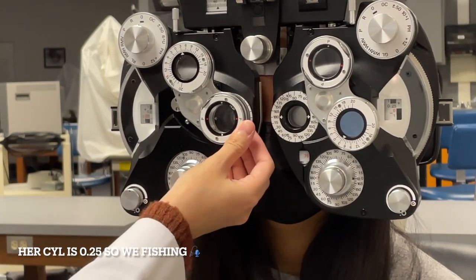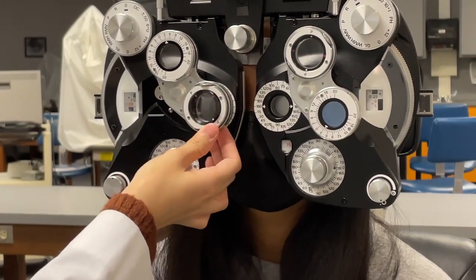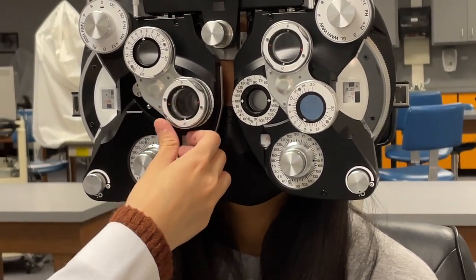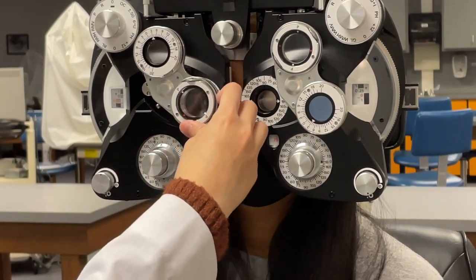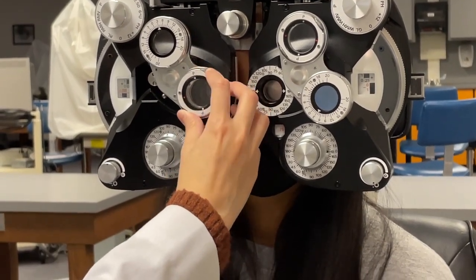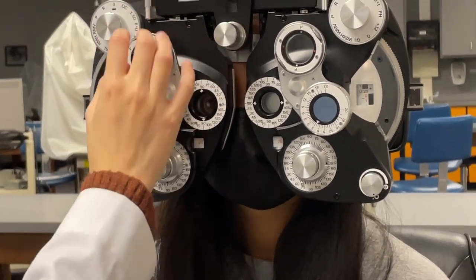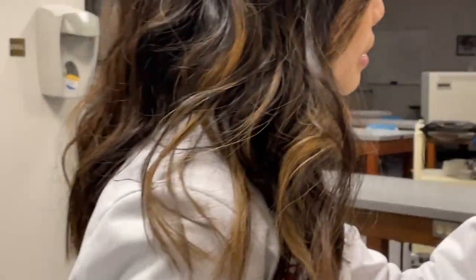So 1 right here or 2? 2. Okay. 1 or 2? 2. 1 or 2? Same. Okay. 1 or 2? Same. And back to power. 1 or 2? Same. Okay. And then I'm going to change the line to a 20-20 line.